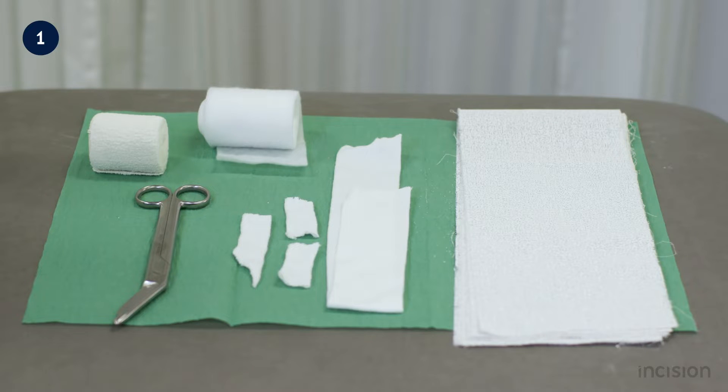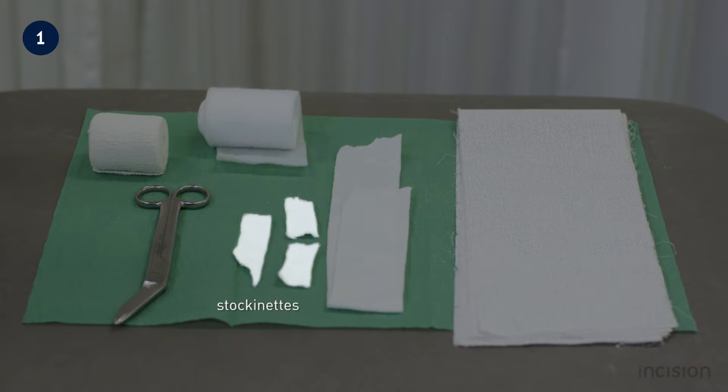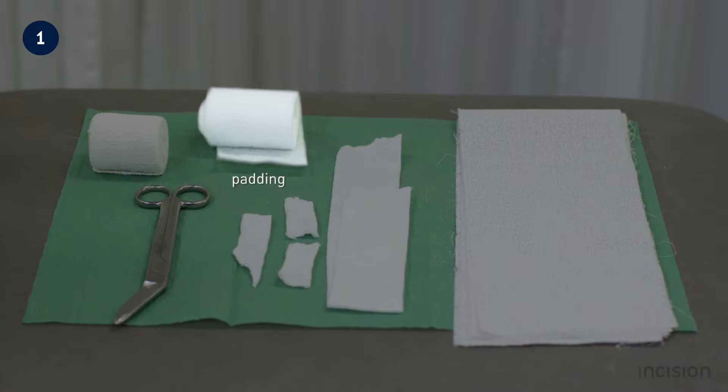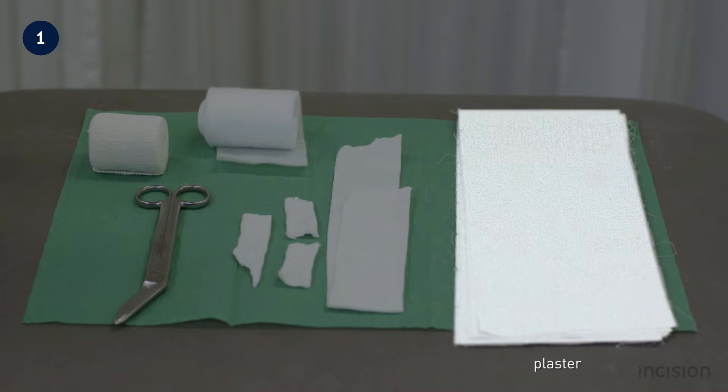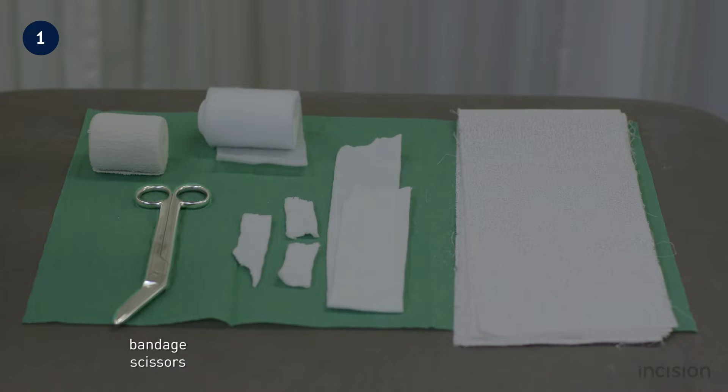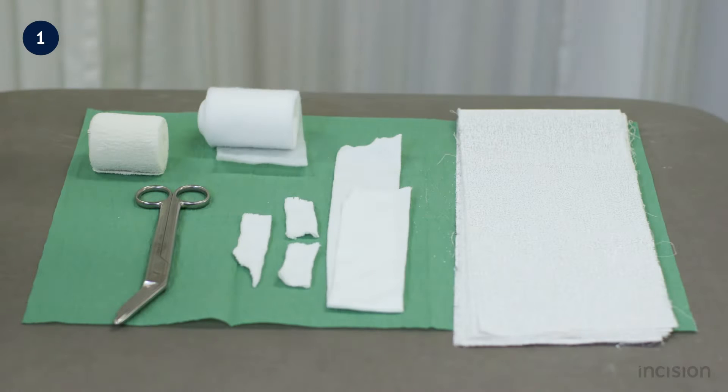The following materials are required to apply a radial gutter splint: three small stockinets each with a width of two and a half centimeters, a stockinette with a width of five centimeters, padding with a width of seven and a half centimeters, plaster — for an average size adult eight to ten layers should be sufficient — an elastic wrap with a width of seven and a half centimeters, and bandage scissors. Note that the size of materials depends on the size of the patient.